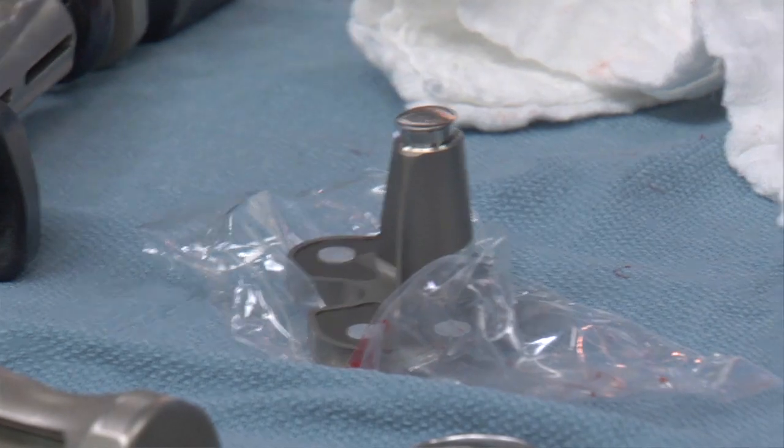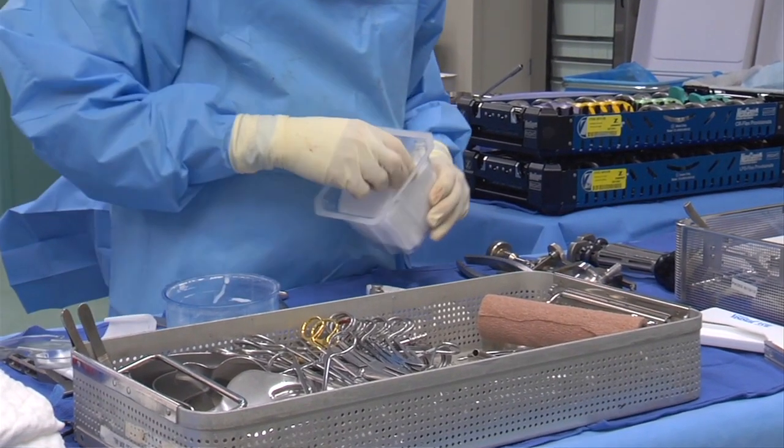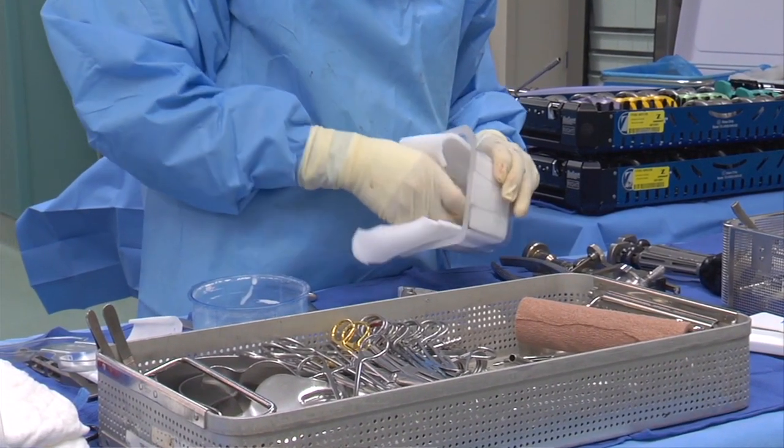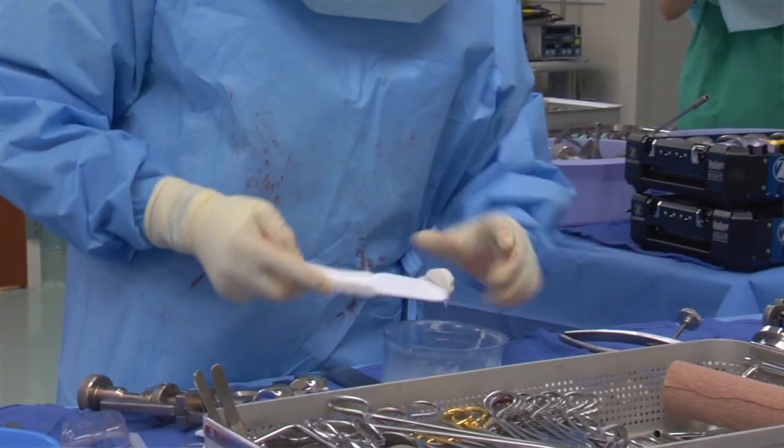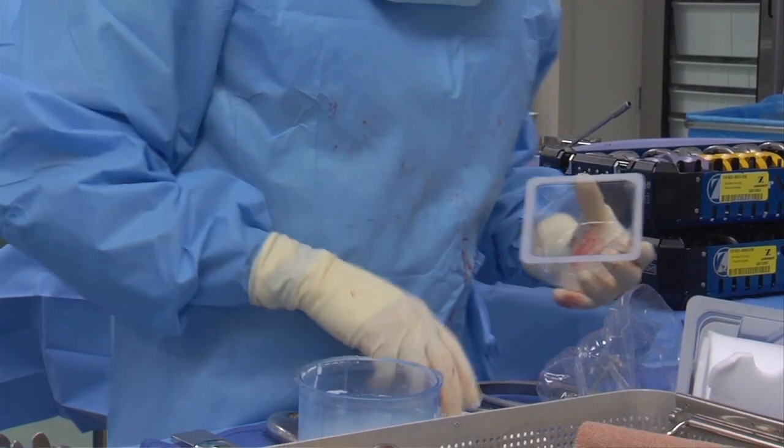We do a trial reduction with the femur and the tibia trials. We then remove the undersurface of the kneecap, saving as much of the bone as possible, and resurface that with plastic. Once we are satisfied with our bone cuts, the alignment, the tracking, and the rotation, we mix a bone cement and cement in the final components.